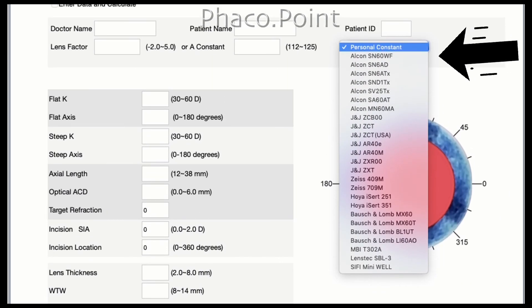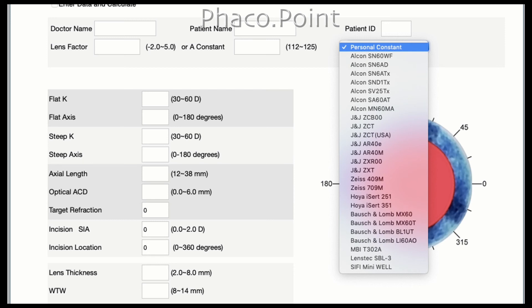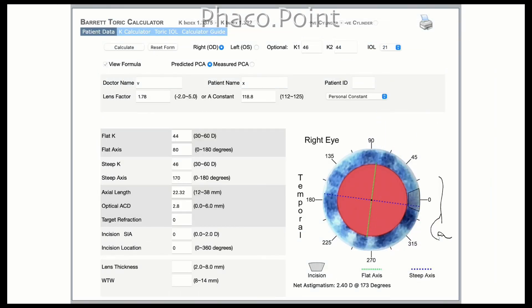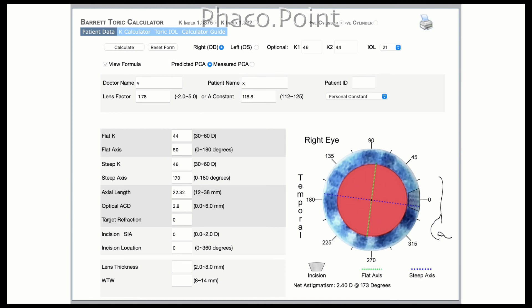From the pop-up menu, choose the toric IOL type and design you intend to implant. If you plan to use an indigenous IOL not listed, choose the personalized constant, enter the A-constant, and select the design that most closely resembles it. Before clicking Calculate, you must choose between predicted PCA or measured PCA — that is, posterior corneal astigmatism. Since most of us have not measured posterior corneal astigmatism, choose the predicted PCA values. If you have access to instruments that can measure posterior corneal toricity, you may enter the measured PCA values.